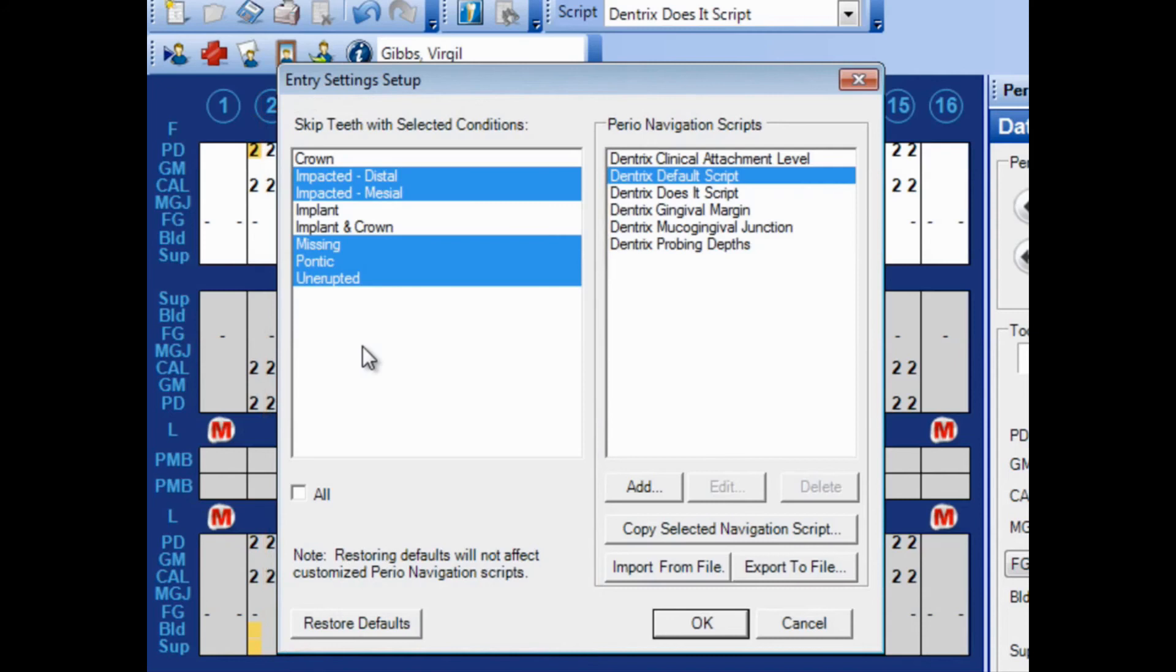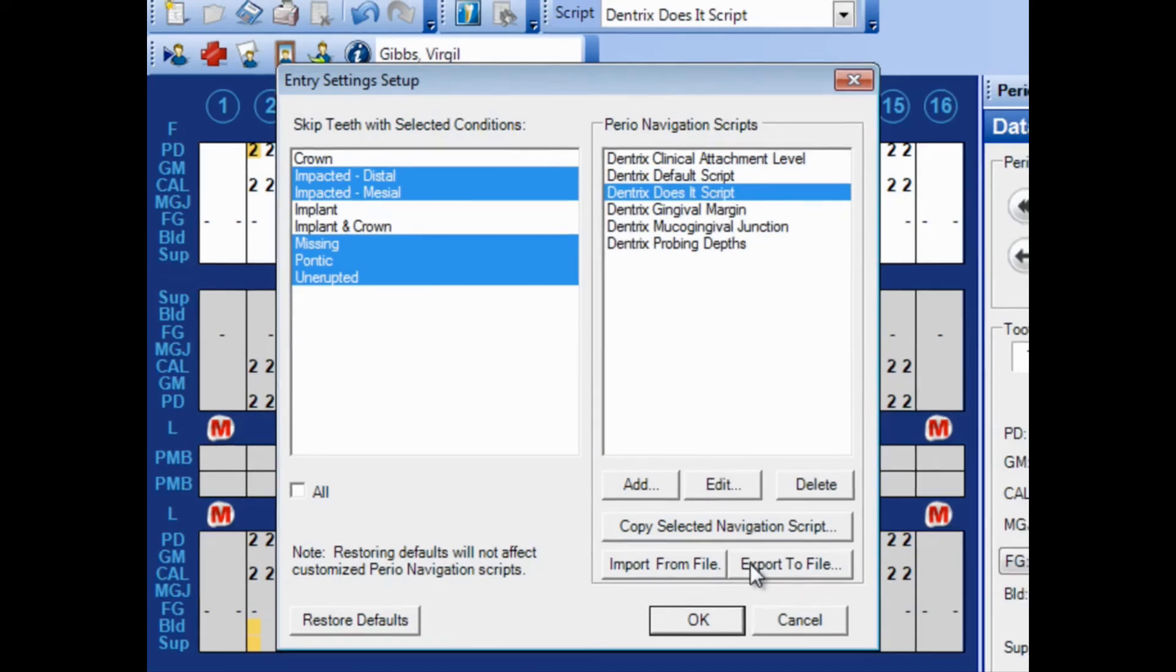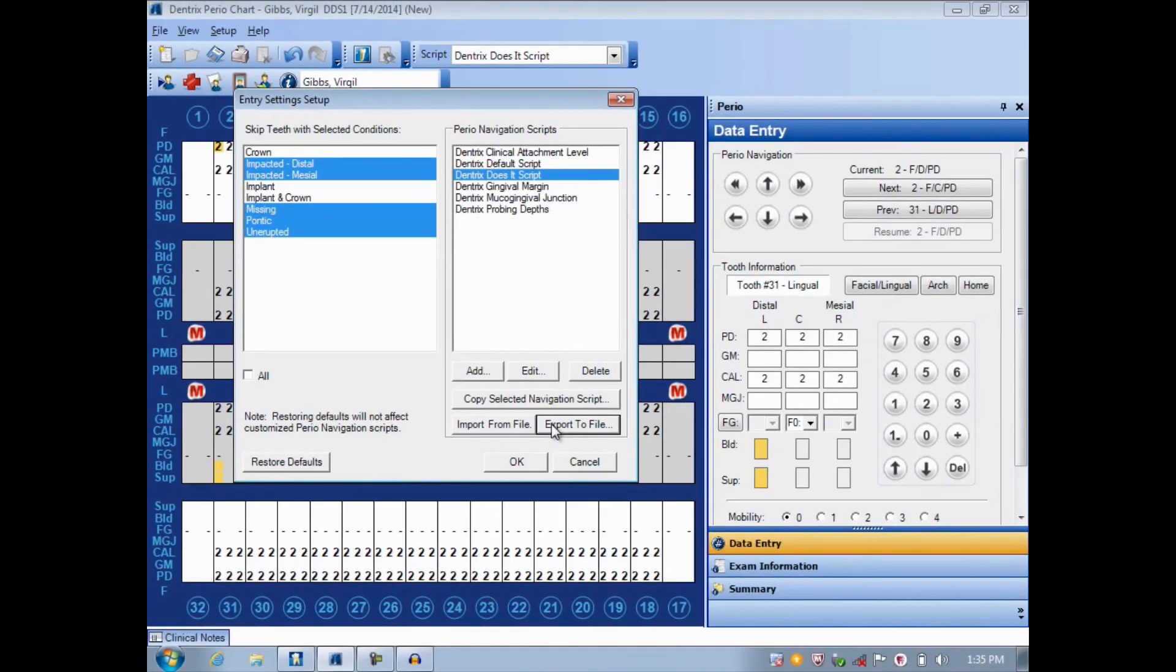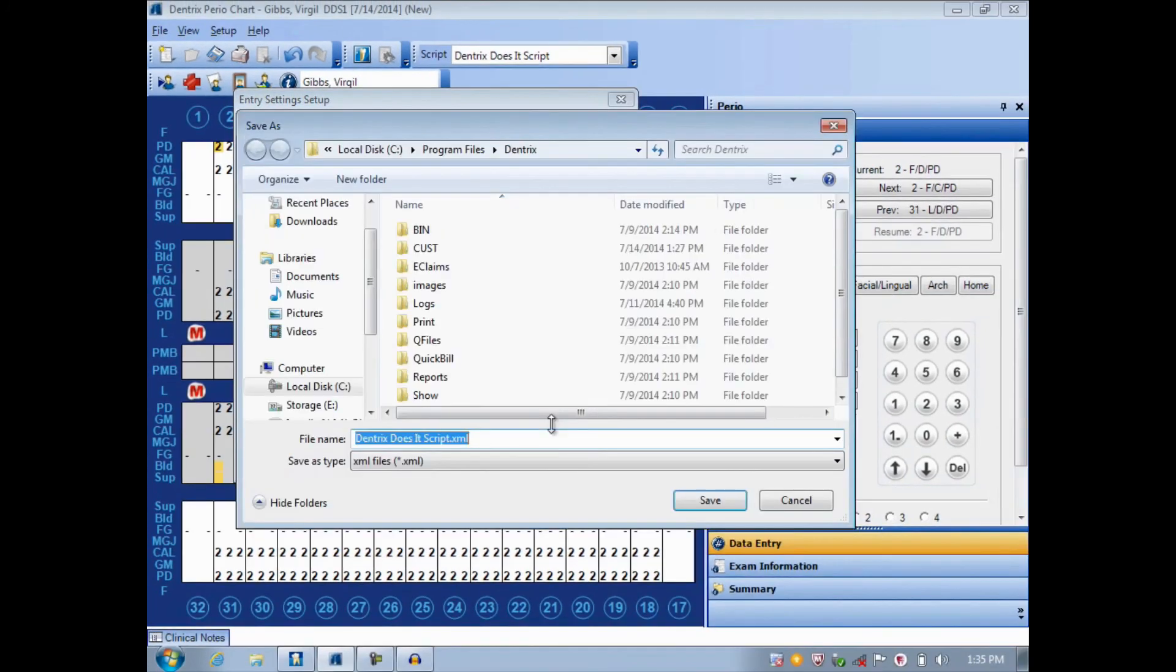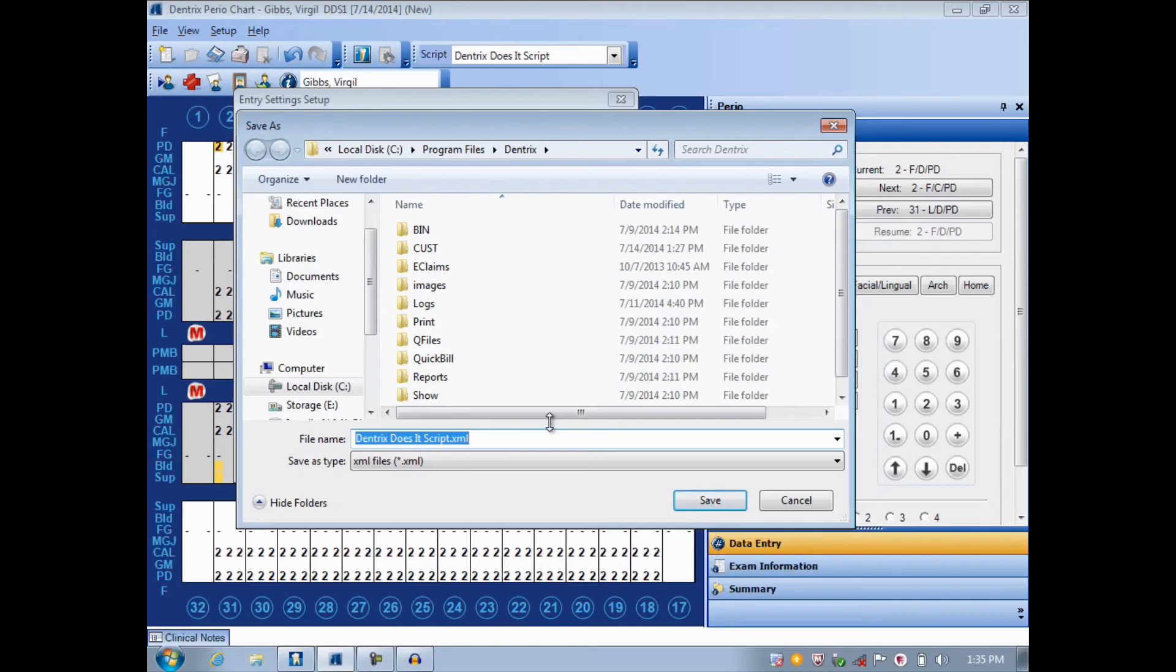Back here at the right, I like my script. I would like it now to appear on all other computers. And so, I click Export to File after, of course, highlighting the script. And it brings up a save dialog. Now, I would want to save this on a place where I can access it from the other computer, such as on a folder on the network or on a USB thumb drive that I can take and plug into the next computer. I'd save this file.